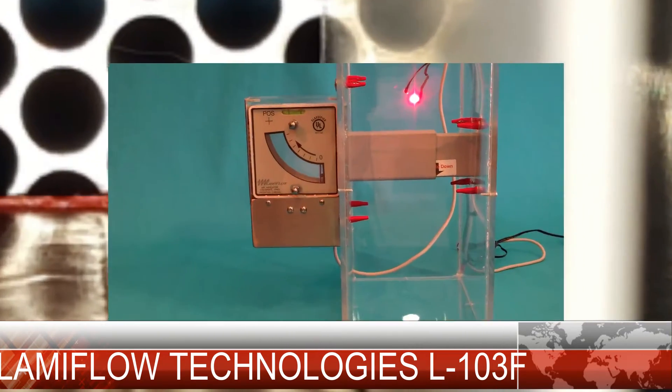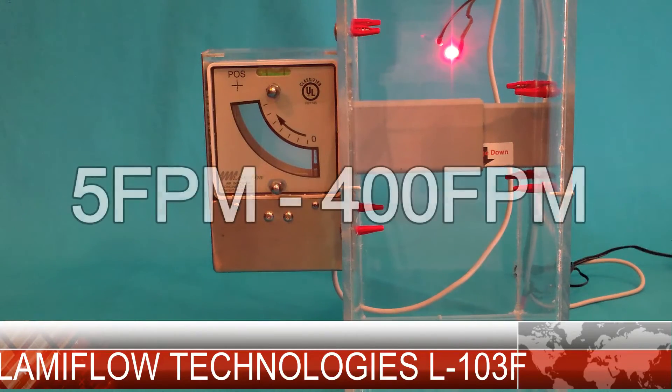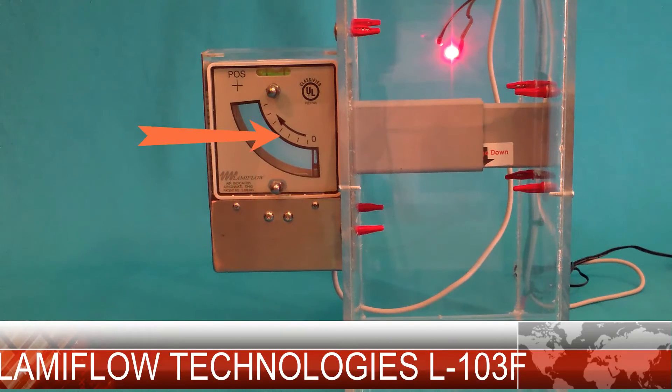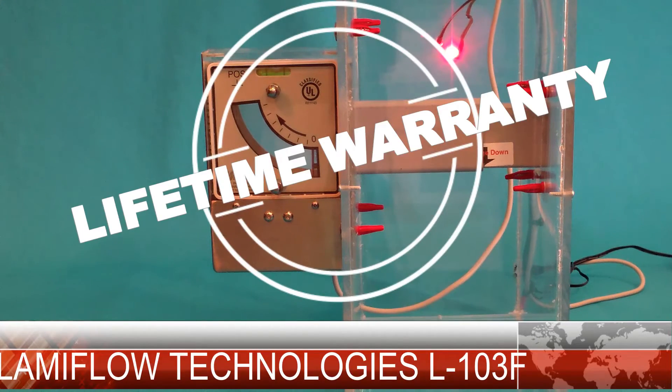Our graduated meter design provides an easy to see and easy to understand measurement for all staff members and your next inspection. They measure airflow from just below five feet per minute to above 400 feet per minute, with room spec of negative 0.10 inches water column falling in the middle of our meter. Our unique flapper design is hypersensitive and will function in a wide range of airflow conditions. We stand behind our products with a lifetime warranty against any manufacturer defects.